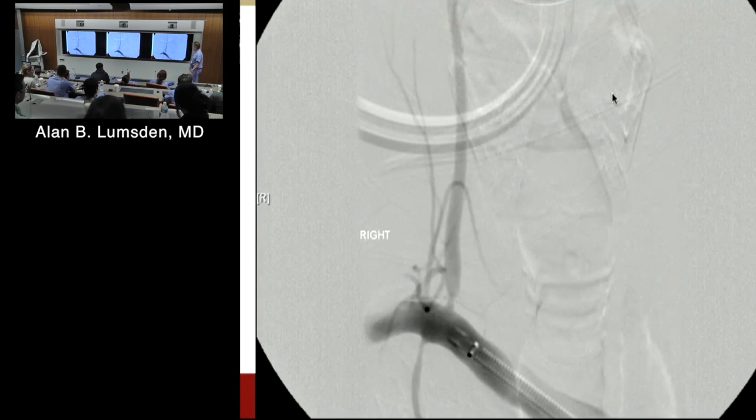Puncture the groin. So this is a sheath that's up here, okay? And you're going to start seeing these devices over the course of the next couple of days. It's got a spiral. What you're looking at is the reinforcement that stops the sheath from kinking. And then you look at the radiopaque markers. This is how you see these things. Normally they're not radiopaque, this one's a little different. You'll see a radiopaque marker band in the end. The catheter always projects a little bit beyond that, and we're going to be injecting through this. This is not them. This is us.